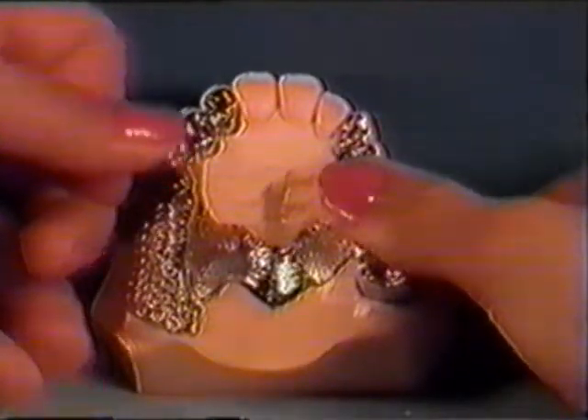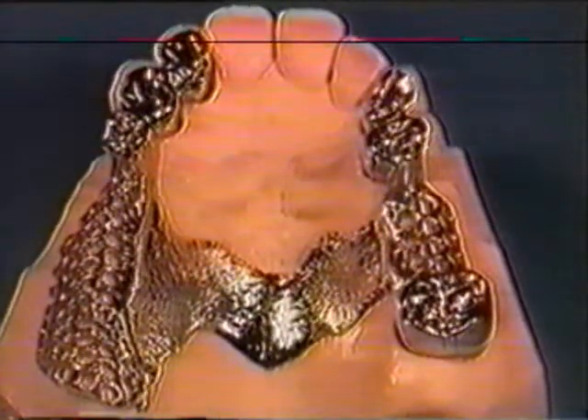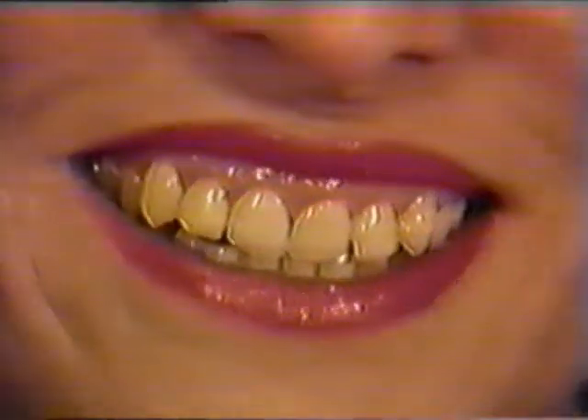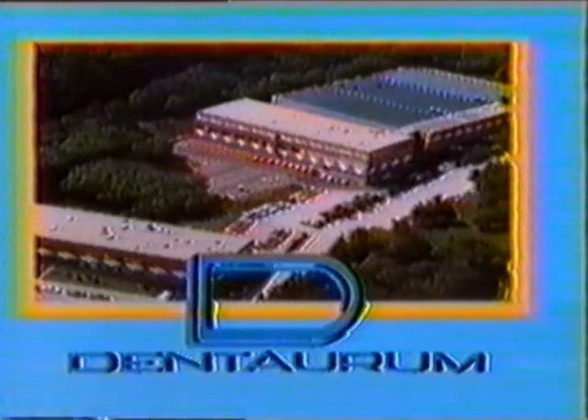The finished combination denture manufactured using the cast-on technique speaks for itself. The advantages of the cast-on technique are obvious: a high degree of precision and a time-saving production method. Not only does the patient receive a high-quality precision denture, the exclusive use of chrome-cobalt alloys also assures better biocompatibility. Dentorum — progress through innovation.